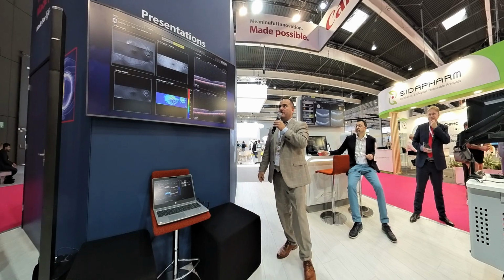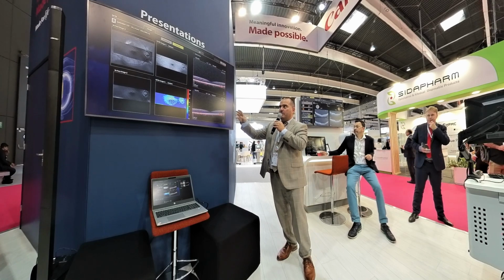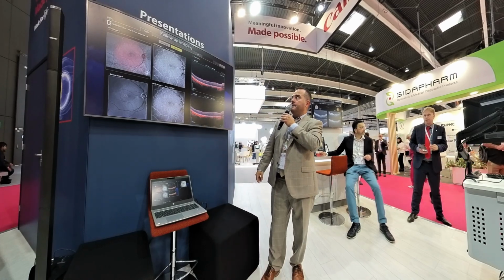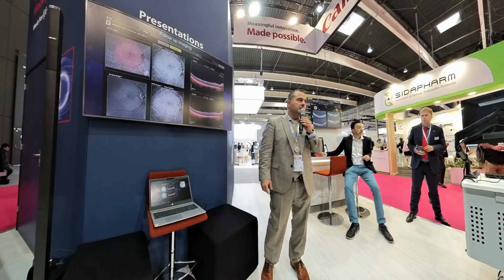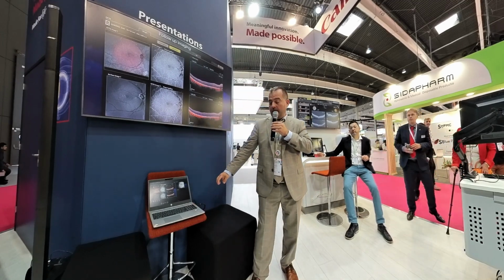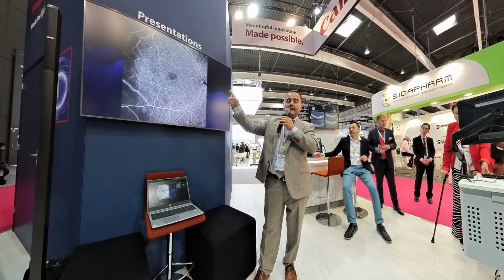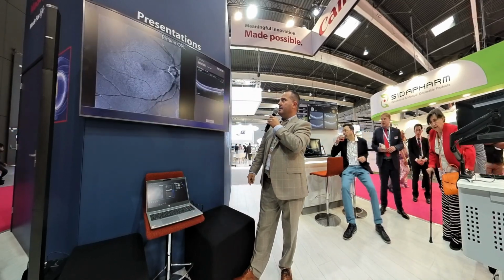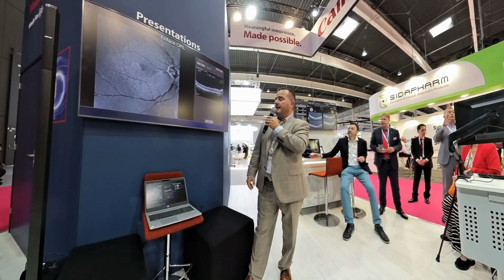Another example of how we can identify the area of affection and where the problem exists, even with the OCTA. And this is the follow-up imaging. Unfortunately, this is a permanent condition which cannot be spontaneously resolved, and there is no proven therapy for that. Again, you can see the area where there is absence of perfusion already. And another example of en-face scanning with the CANON machine.